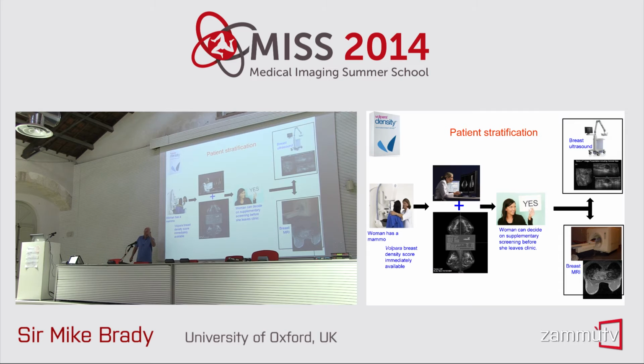A woman has a mammogram, the doctor will look at it, but before the doctor looks at it, we can come up with a measurement of the amount of breast density, and then before the woman leaves the clinic, she can be told, Mrs. Jones, our new technology tells you that you have particularly dense breasts. We recommend that you have an ultrasound before you leave the clinic. And by the way, because you've got BI-RADS 3 or 4 according to our machine, your breast ultrasound will be reimbursed. It won't cost you a penny. Suddenly, there's been an increase in the number of ultrasounds by a factor of 10.